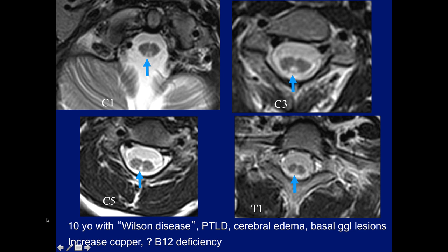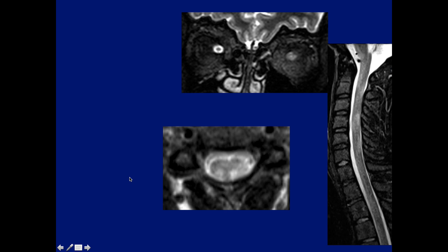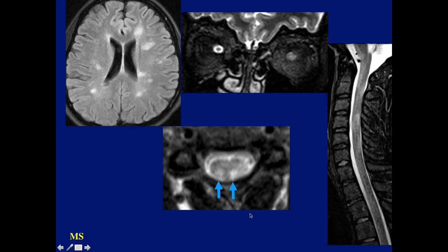Here's a patient that Ajay and I looked at — a 10-year-old with questionable Wilson disease, liver failure, transplant, cerebral edema, basal ganglia lesion, questioned increased copper and B12 deficiency — and again we see abnormal signal in the fasciculus gracilis and possibly also in the cuneate. Here we also have a patient with cord lesions and typical abnormalities involving the optic nerve with abnormal signal in both fasciculi gracilis — a case of MS, which can also involve the posterior columns.